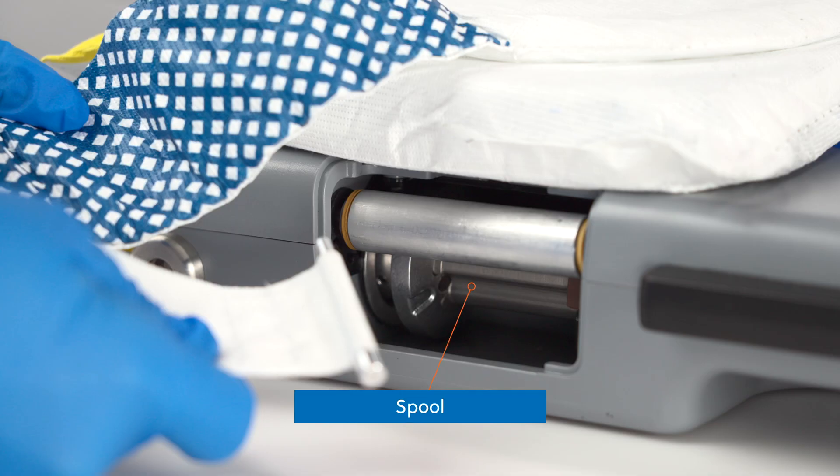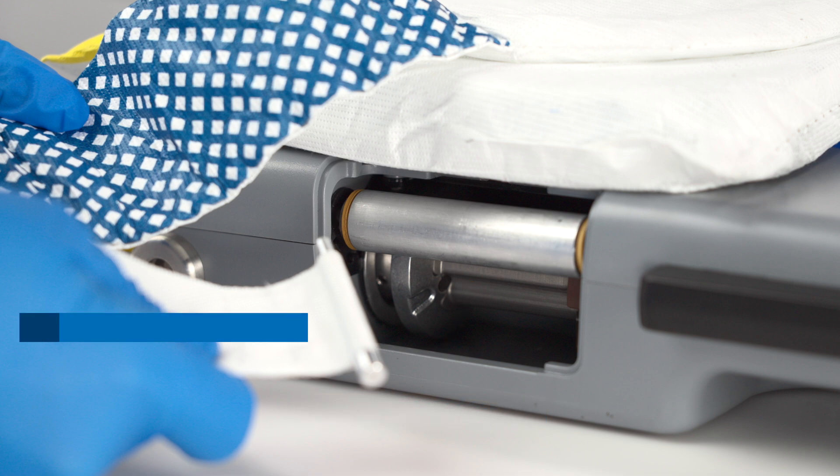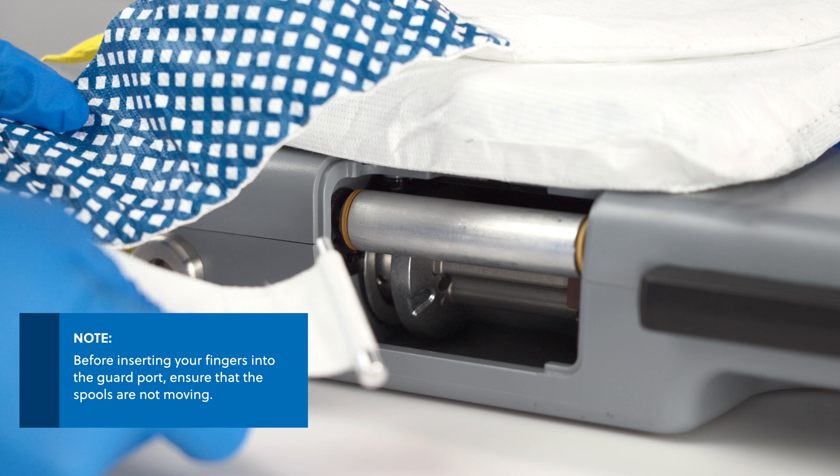In the guard port, ensure that the spool on each side of the platform is oriented so the slot is facing out. Before inserting your fingers into the guard port, ensure that the spools are not moving.